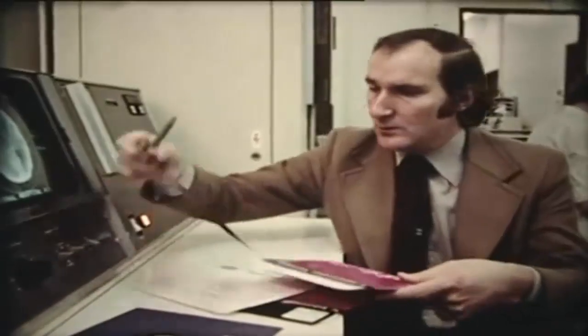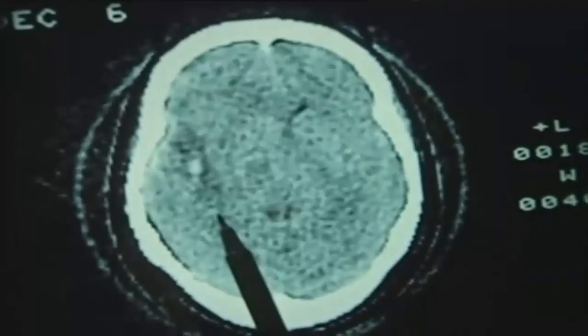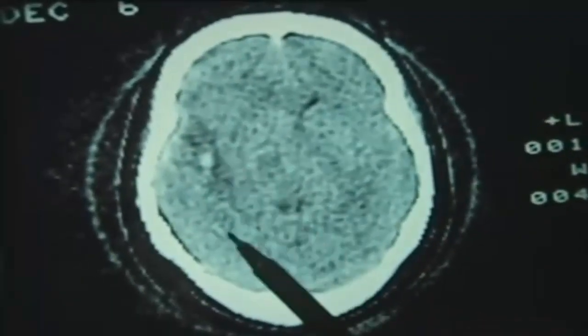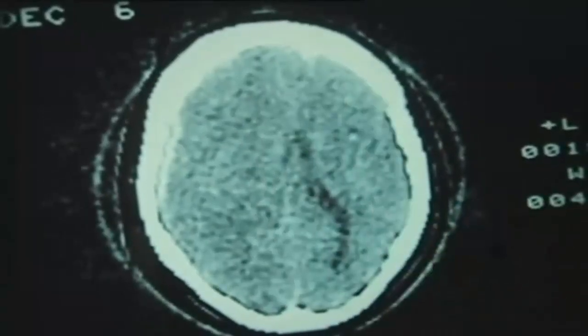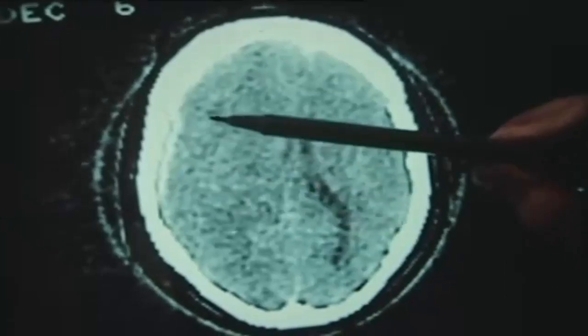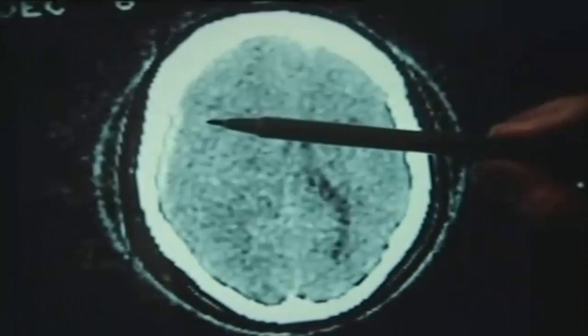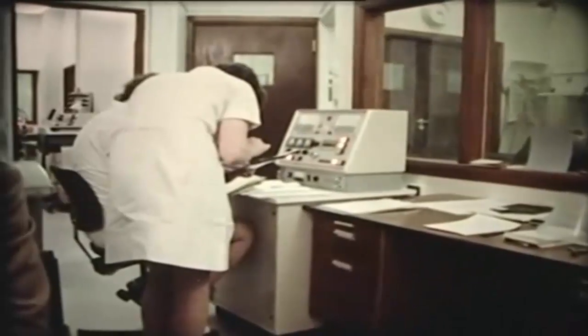This is a girl who, after a party, was beaten up by her boyfriend. Here on the left side is the area of contusion, which is seen as an area of low density, with little spots of blood within it. On the next cut, you can see the ventricles once again displaced away from the side of the abnormality. And some blood here, which is seen to be less dense than the skull, lying between the brain and the skull. The scan explains her condition, but it is also clear that this is a condition which does not require surgical treatment, which is very important in the management of this patient.